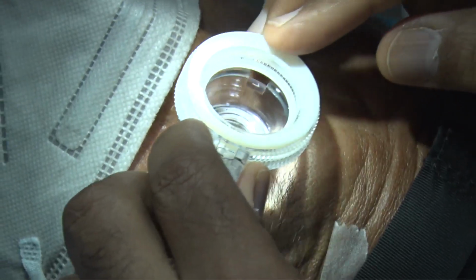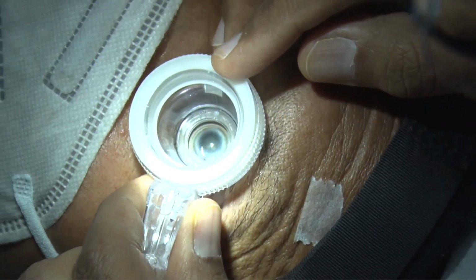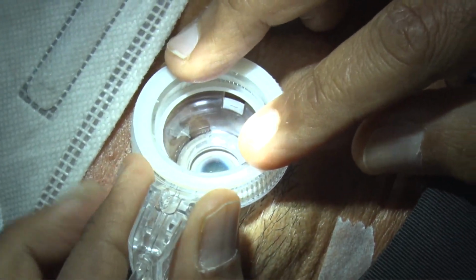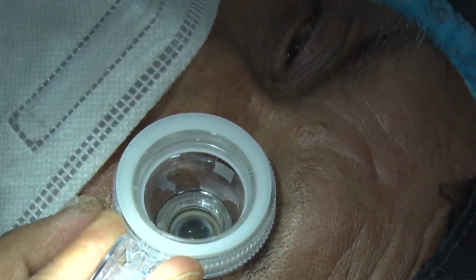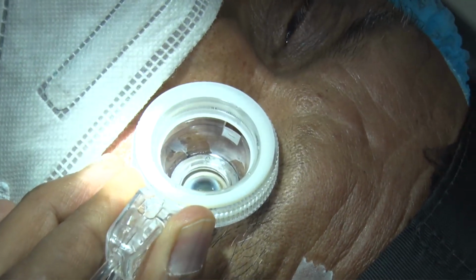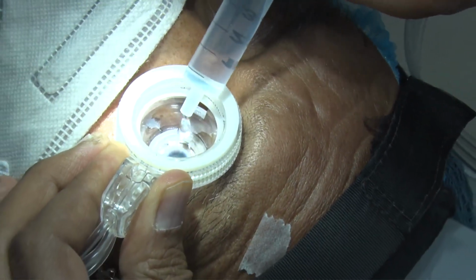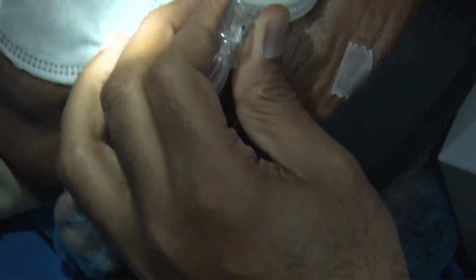There are sizes to the interface. Keep watching in the light. So I've done the vacuum capture now. If you show the machine there, it's captured. And now we are going to slide up. Show it here, from the side. Fluid. Now we are going to put some fluid there. This is going to form the fluid interface. And now I slide the bed under the laser, and this is going to dock. Wait, do it when I say. Yes.